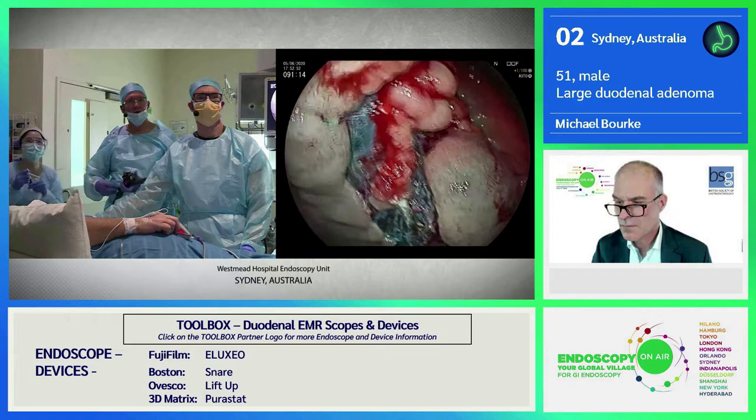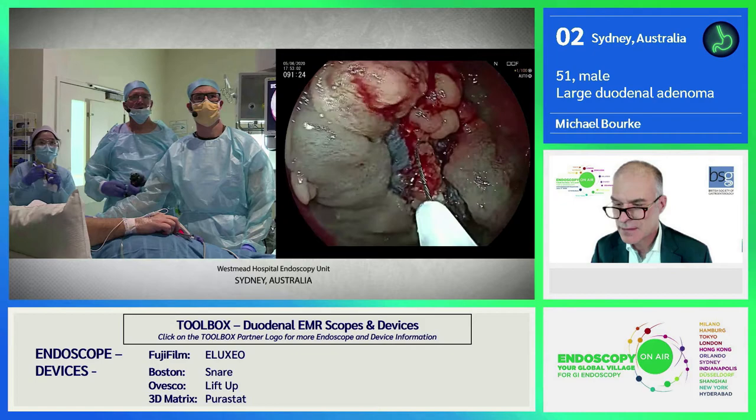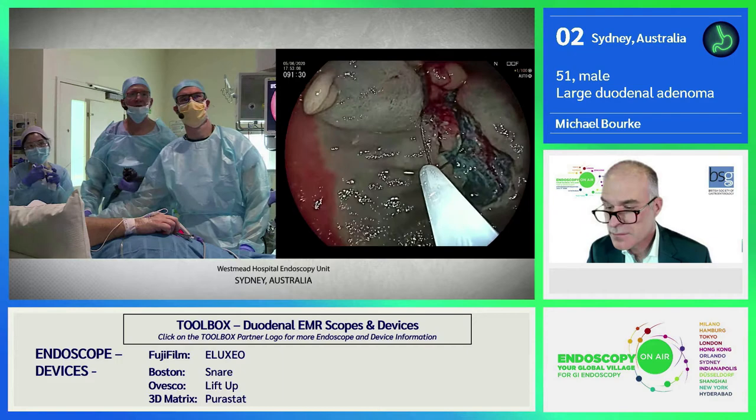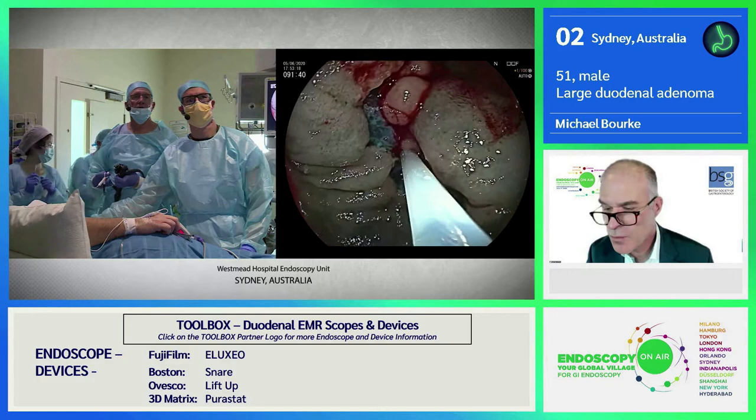So go up here. So I want to go on the other side. Keep holding. Slowly close. Resistance, don't cut through. Yeah, so, okay. Michael, you've got about two more minutes of live.